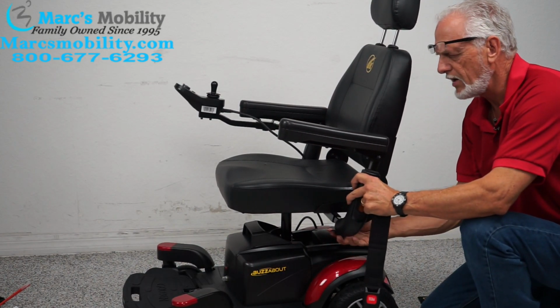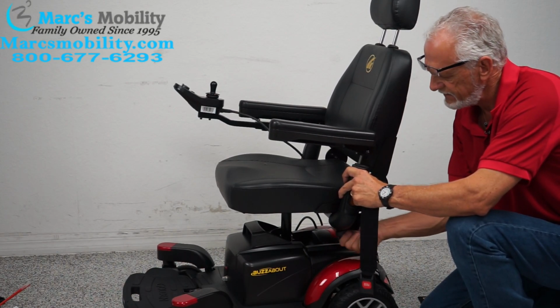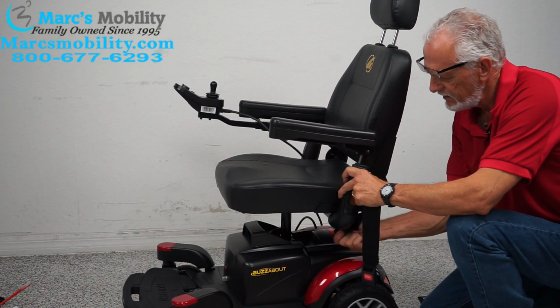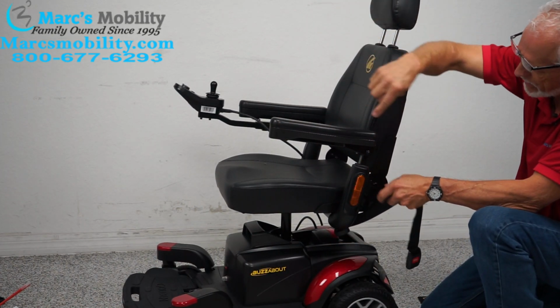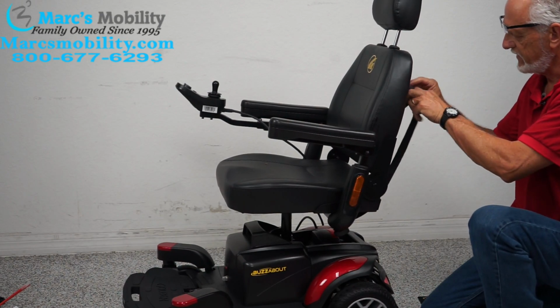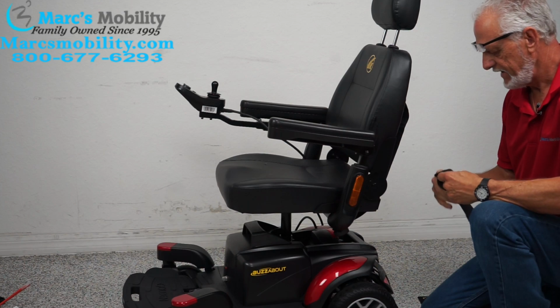If you want the arms wider, you can move them out before you tighten them up. As I said, if you're left-handed, the only thing you'll have to do is take this part right here off that side and bring it on this side for your joystick to be on this side. So that's how you put the safety belt on.